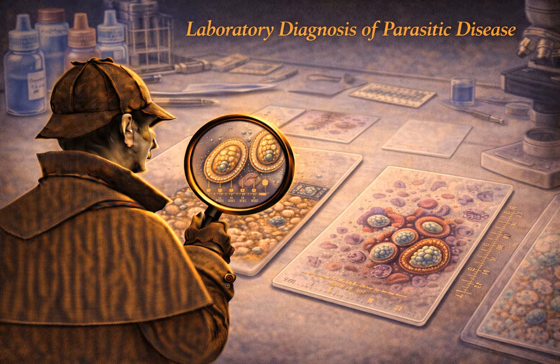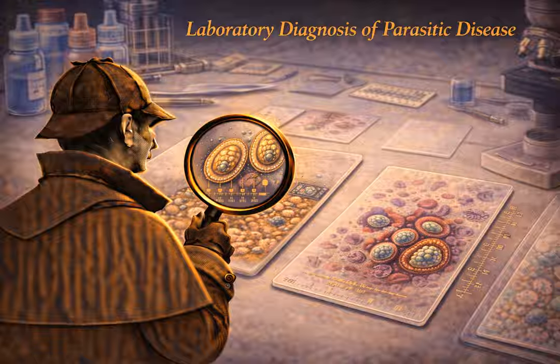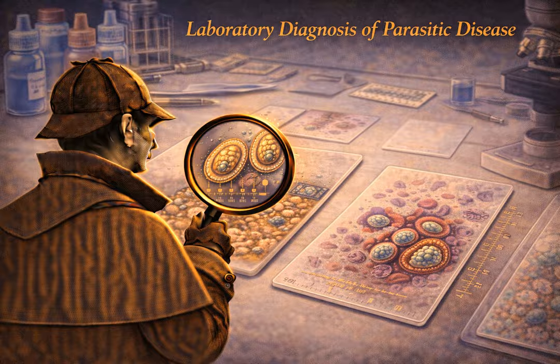Okay, let's talk about the physical sample itself. We have the cup, we have the specimen, what actually happens to it? Again, the biology dictates the handling. This heavily depends on the physical consistency of the stool. If the stool is purely liquid, it implies a very rapid transit time through the gut. Things are moving fast. Therefore, the parasitic forms most likely to be present in that liquid are the trophozoites.